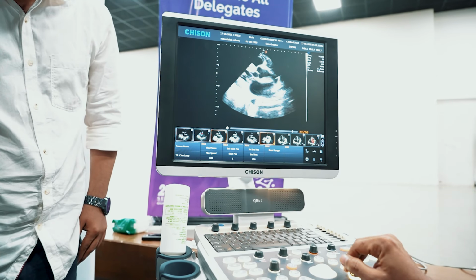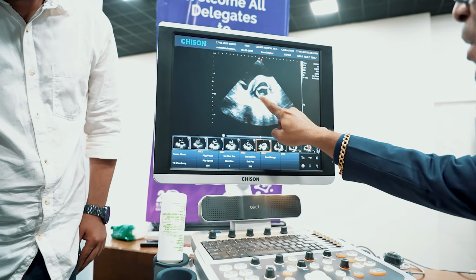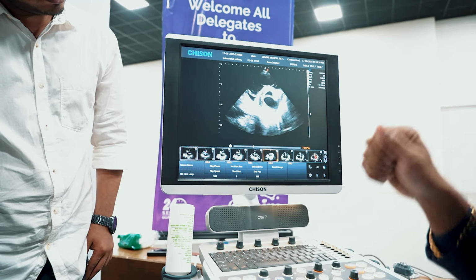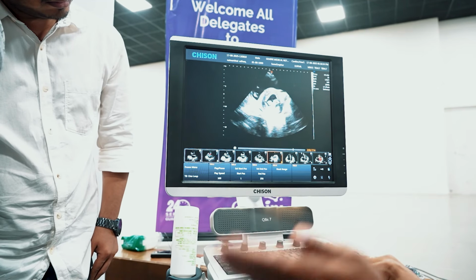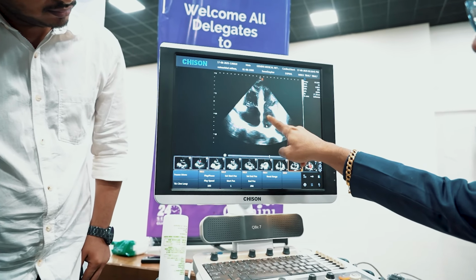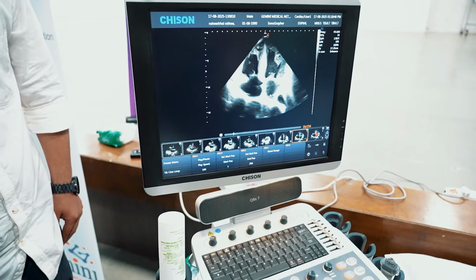If we try to change the orientation of the images, this is again your mitral leaflet and you can see one mass coming and going from the posterior mitral leaflet inside the mitral valve surface area. So this is the mass which is attached. If I again change the orientation and come to the 4-chamber view, again you can see one echogenic, freely mobile mass-like structure which is attached more to the posterior mitral leaflet than the anterior.